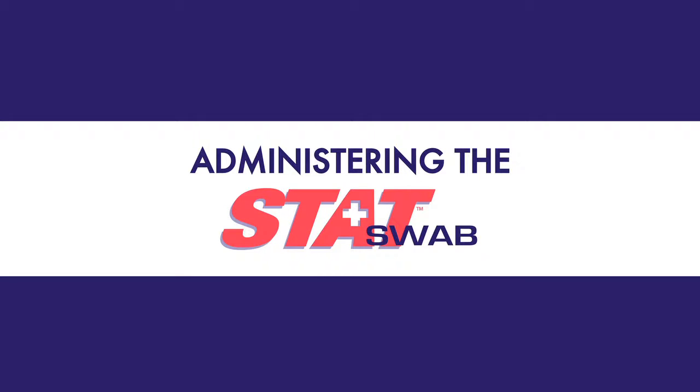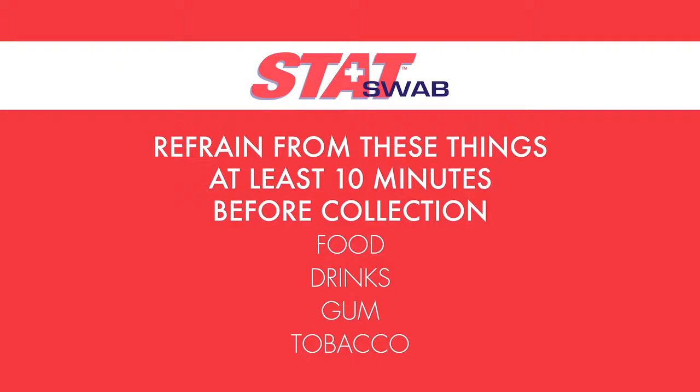Administering the STATSWAB. When you are ready to administer the STATSWAB test, instruct the donor to refrain from placing anything in his or her mouth for at least 10 minutes before collection. This includes food, drinks, gum, and tobacco products. Use this period to go over paperwork and instructions with the donor.